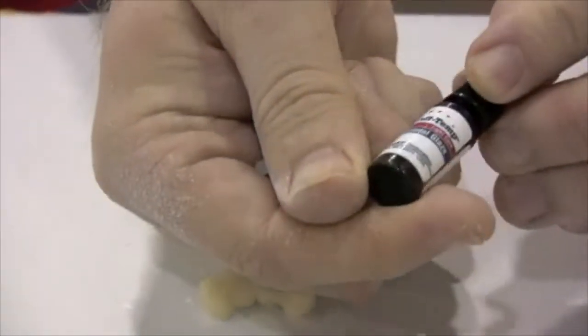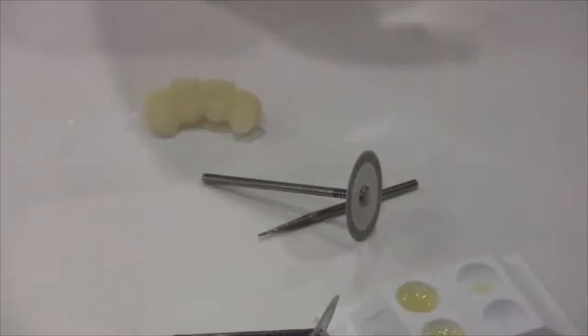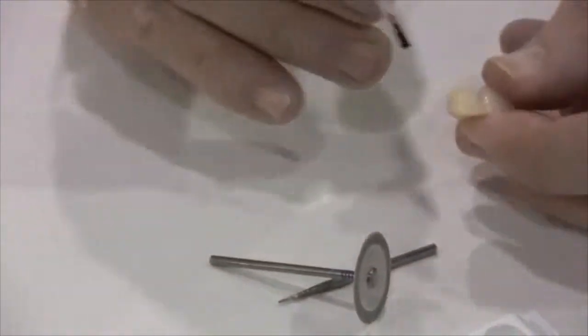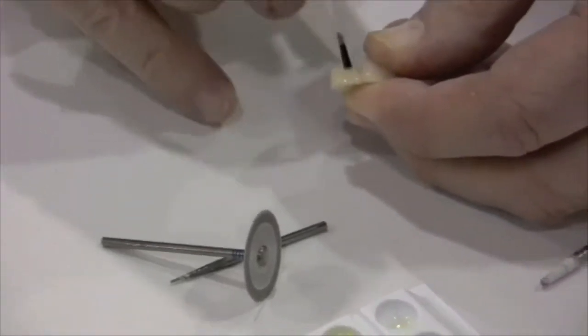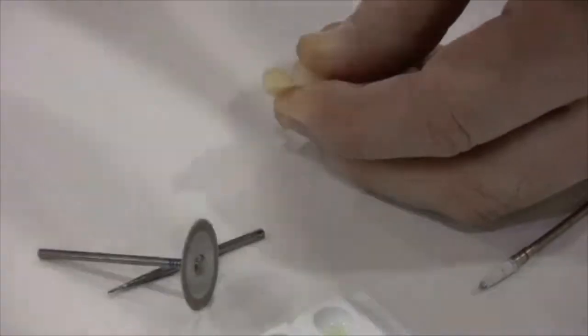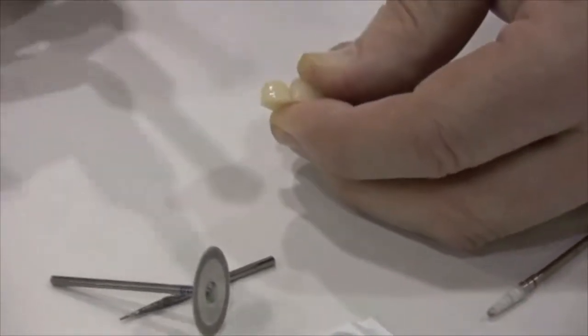Placing the provisional glaze will actually help to seal the material and make them a little bit more stain resistant. So we can just paint that into place, and then light cure.